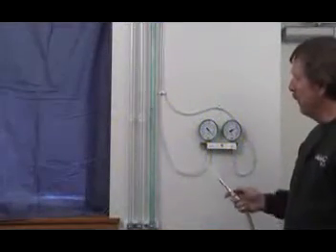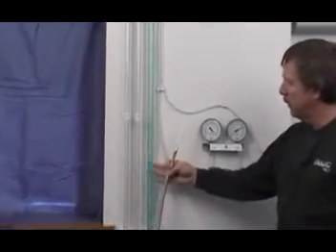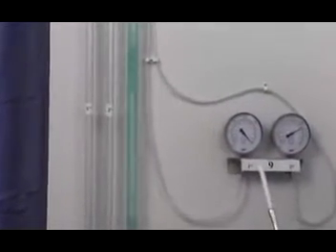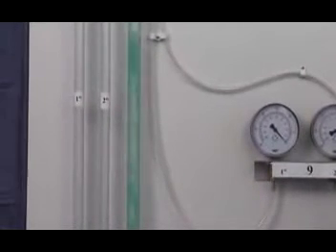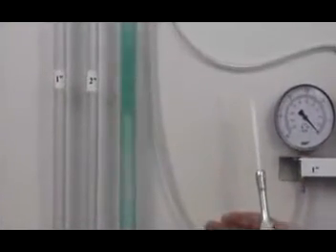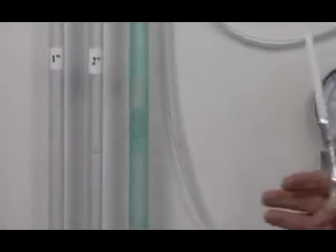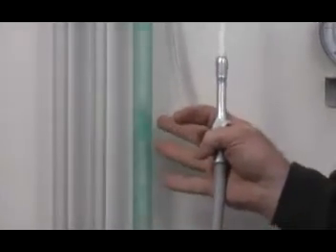If you get into overhead piping and you have a riser that is larger than half an inch, this being 3/4 inch, you will get a tremendous amount of tumbling from air leakage through the HVE or possibly through the trap into the pipe, and the liquids will not clear the line. And when this happens, you will have a tremendous amount of noise. It'll be a water-type gurgling sound, and it's very loud in the operatory. We get a lot of comments on this as to why it's doing this, and it basically is that the riser pipe is too large for the liquids to clear.